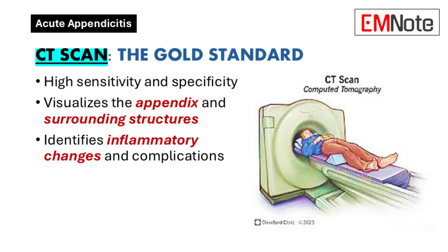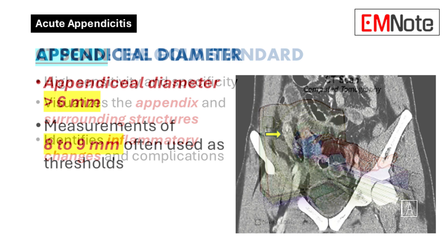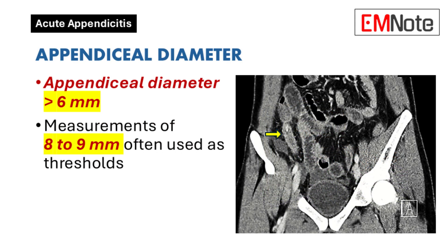CT findings in acute appendicitis: Appendiceal diameter. A key diagnostic criterion is an appendiceal diameter greater than 6 mm. Measurements of 8 to 9 mm are often used as thresholds for diagnosing appendicitis, although this can overlap with normal variants.